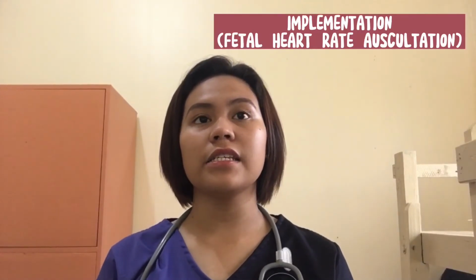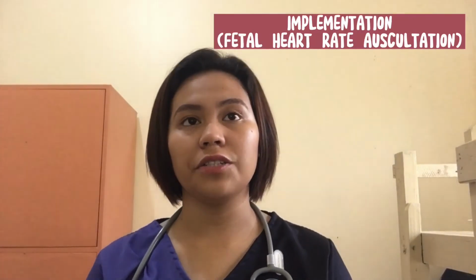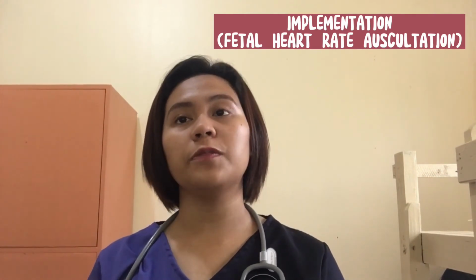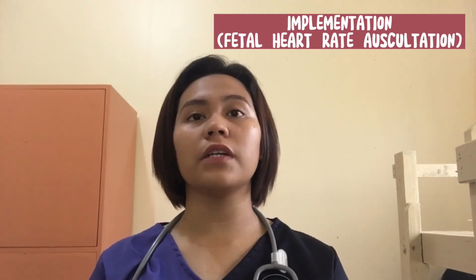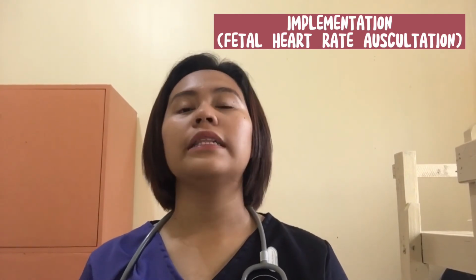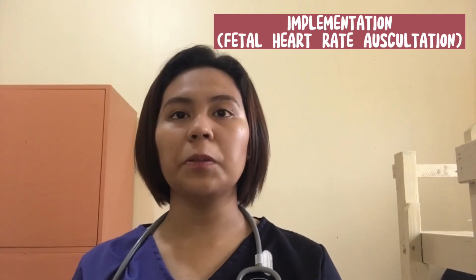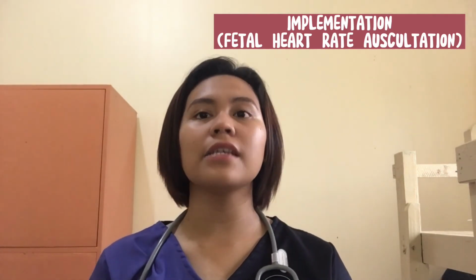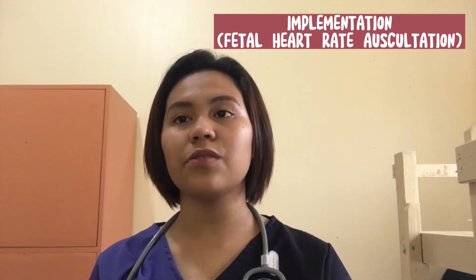So next is the fetal heart rate auscultation. So we need to place the bell side of the stethoscope chest piece on the fetus's convex portion closest to the anterior uterine wall. Listen by pressing in firmly and very gently. Count a full minute holding the stethoscope chest piece while the other hand feels for the client's radial pulse.